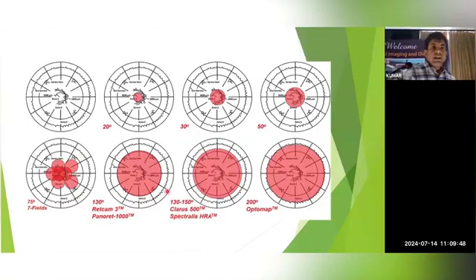So this is the comparative picture which I was telling. If you examine with an indirect ophthalmoscope, you see up to 20 degrees in a single field, 30 degrees of the fundus you can see with the standard fundus cameras, and some fundus cameras give up to 50 degrees. We can see so much of the peripheral retina remains undocumented on imaging.